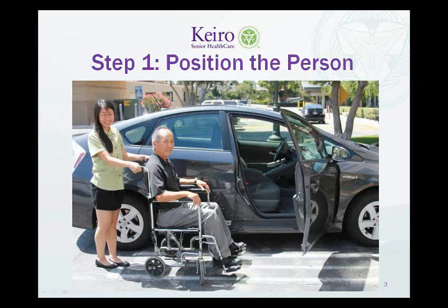Step 1. Position the care recipient behind the passenger door alongside the car. Inform them about the transfer and what you are going to do. Ask them to help you if they are able to. As you transfer the care recipient, continue to talk them through the entire process.